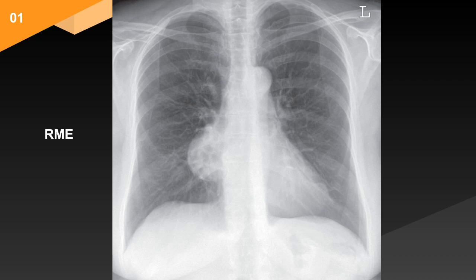This is a frontal chest radiograph of a skeletally mature patient. A relatively homogeneous soft tissue density is projected medially in the right mid and lower zones. It is rounded and well-defined laterally, but the medial aspect is not visualized separately from the mediastinum. It forms obtuse angles with the lung, implying a mediastinal rather than a pulmonary mass.